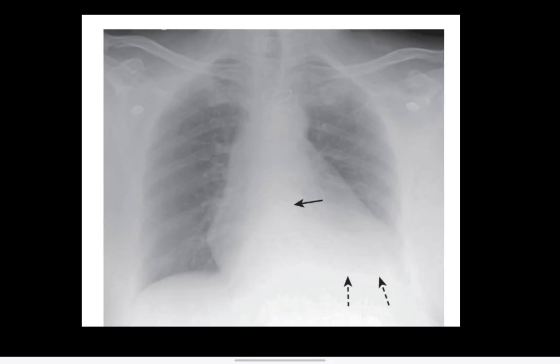Another question regarding this image. Count the cardiothoracic ratio in this image. What do you think? Okay, it looks like that because of the magnification, the cardiac contour is almost more than 50%.